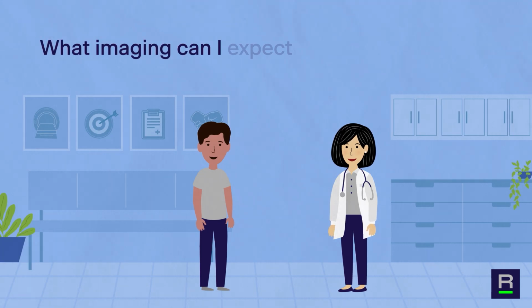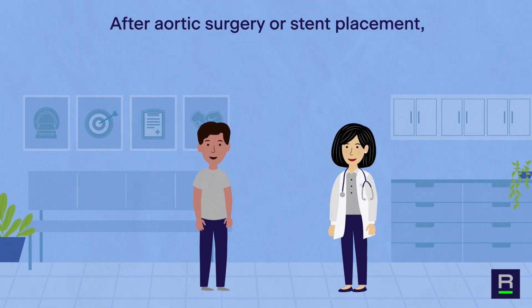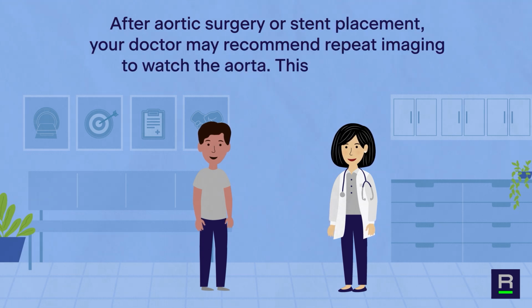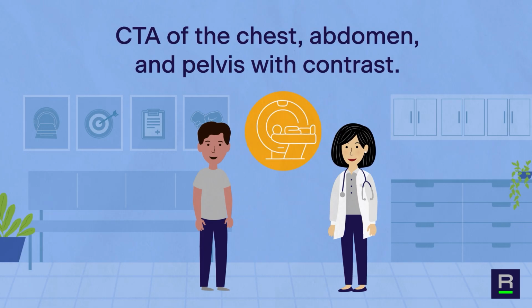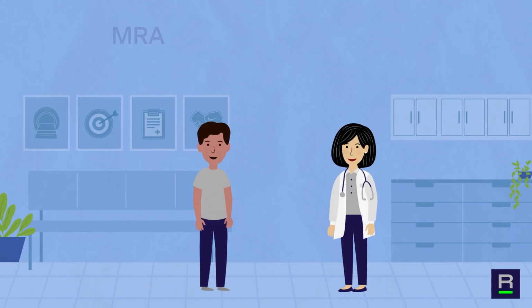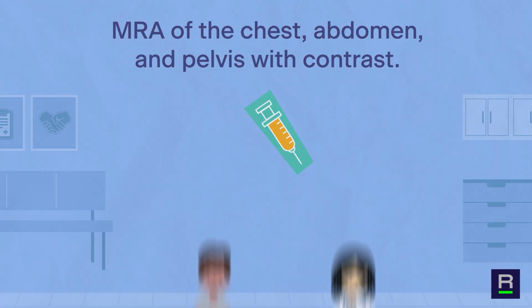What imaging can I expect after the procedure? After aortic surgery or stent placement, your doctor may recommend repeat imaging to watch the aorta. This may include CTA of the chest, abdomen, and pelvis with contrast, CTA of the chest with contrast, MRA of the chest, abdomen, and pelvis with contrast.